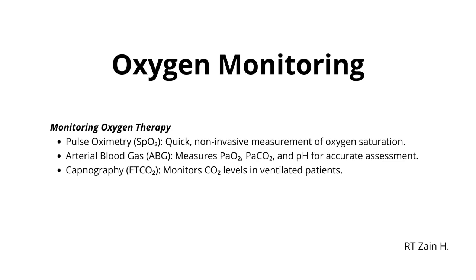Oxygen monitoring. Monitoring oxygen therapy. Pulse oximetry, SpO2: quick, non-invasive measurement of oxygen saturation. Arterial blood gas, ABG, measures PaO2, PaCO2, and pH for accurate assessment. Capnography, EtCO2, monitors CO2 levels in ventilated patients.